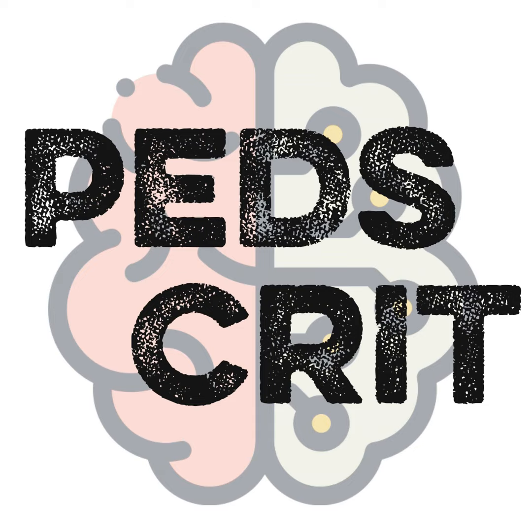When you have these patients at the peak of their respiratory illness and they're on the oscillator, on 25, 28, 30 mean airway pressure, how do you do respiratory clearance? Are you breaking the circuit for bagging and suctioning? Oh, no. It's always closed inline suctioning, like with conventional. The nurses do it routinely once a shift, maybe twice a shift, and then upon indication.